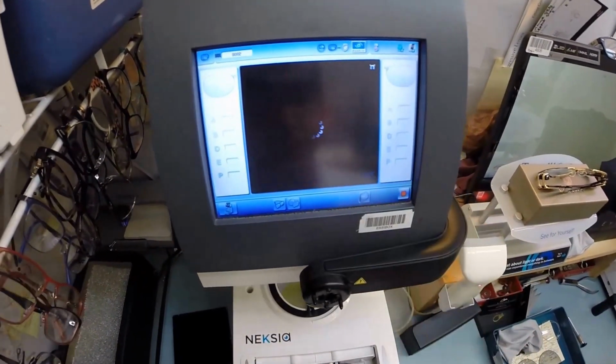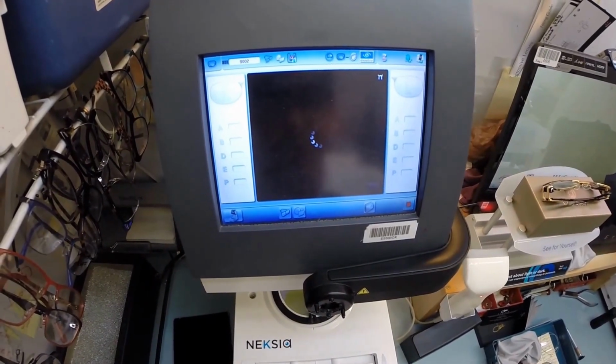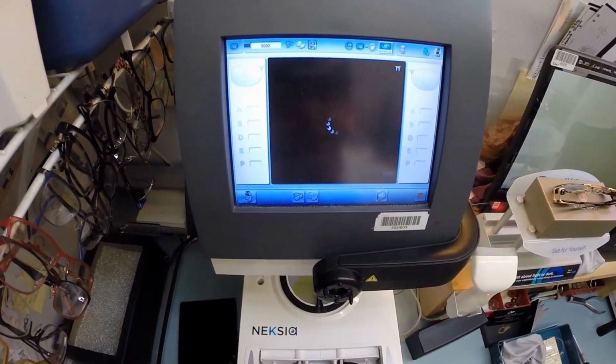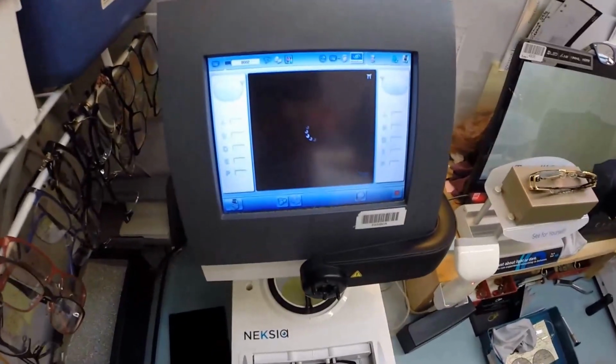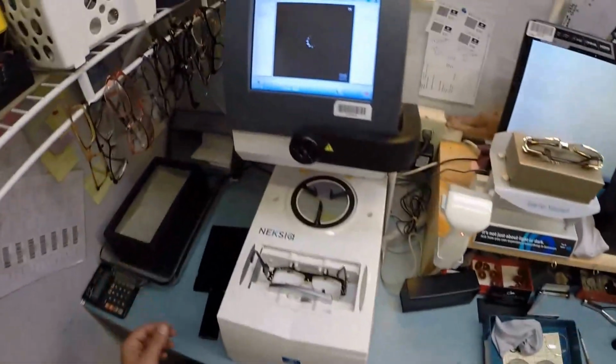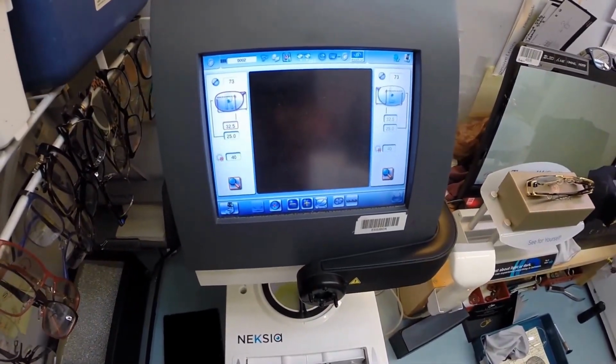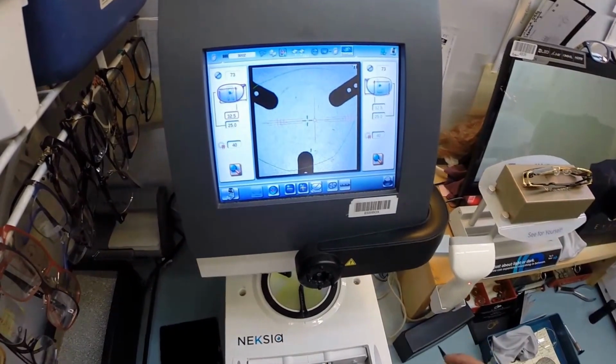Now, as soon as this thing quits circling, the shape of the lens will pop up. All right, here we go. This thing needs to speed up. I'm working on outdated software. Come on, computer. Man, what does $40,000 buy you nowadays? Come on, you slow thing. There we go. Pop up on the screen. I guess it says you can't rush perfection.